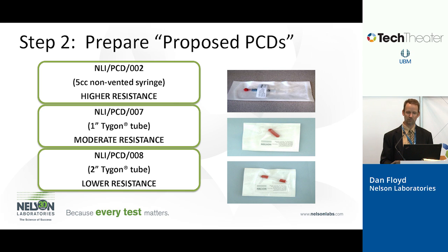And so generally, we'll try all these different ones. We'll put those process challenge devices that we're going to try. We don't know which one's going to work, so we'll try several different ones, and we'll mix those evenly in with the product because we're doing a direct comparison of two different items. We want to compare the product to that process challenge device. And again, the product is going to be inoculated at multiple locations, all these different sites.